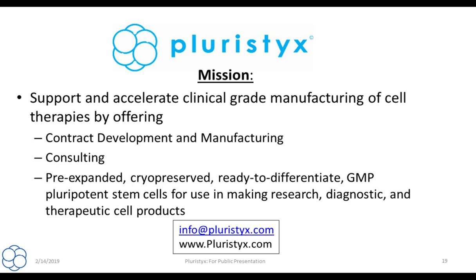Thank you, Ben. And one audience member would like to know, to your slide 18 point, how important is quality by design to you? So quality by design essentially is asking the question beforehand, testing the parameters of your process. It's a little bit easier to do with a master cell bank. Really what you're looking for is population doublings, and essentially you're controlling for risks and stresses in the process early on. I think it's important to use, but I don't know exactly how much work is required to do quality by design early on. I think having a good master cell bank probably feeds more directly into quality by design later on in the process, so that you have a starting consistent process and product from the bank that you can use for manufacturing later on.